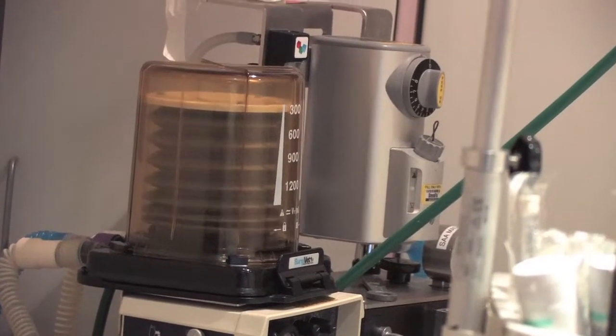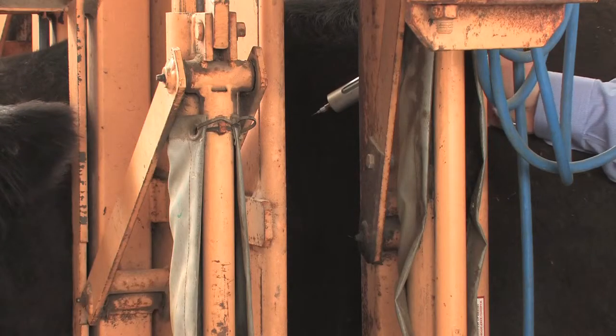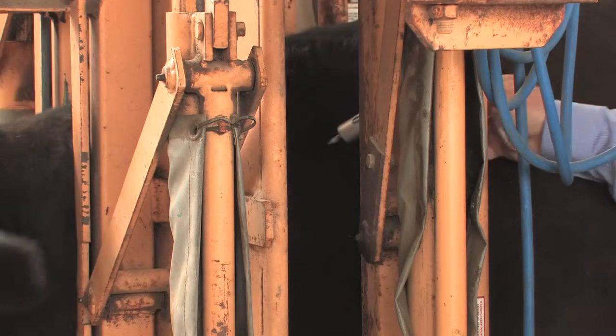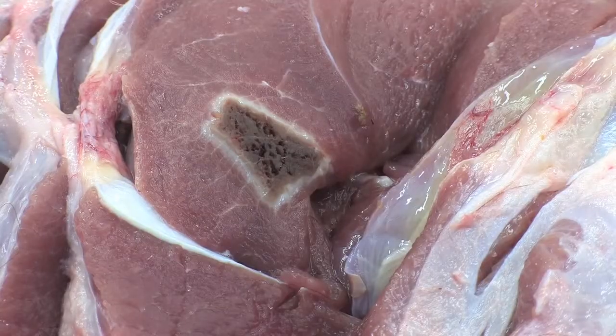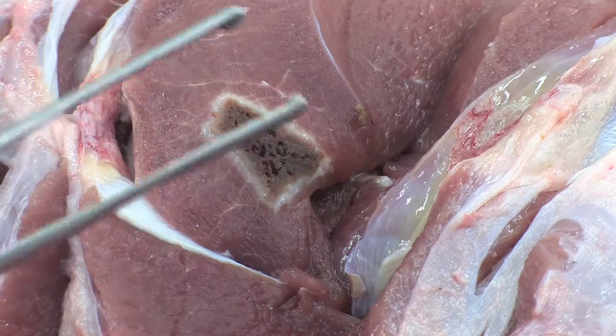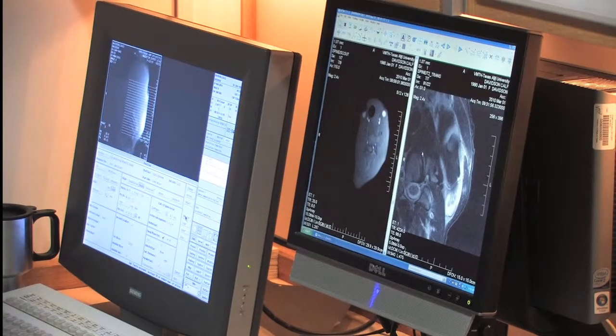The calf is asleep in the MRI imaging tube and we are doing a series of images to show the effect of the inappropriate injections, how they affect the muscles and ultimately the meat products. The goal of the MRI is to give the producer another way to think about how those products, when they are placed in the muscle, how they ultimately affect the product — whether it's trim loss or lesions that might show up when the retail product hits the cooler case and would ultimately affect consumer confidence.